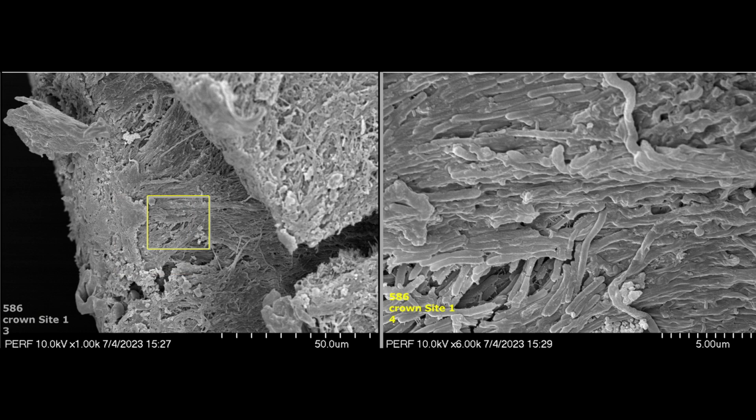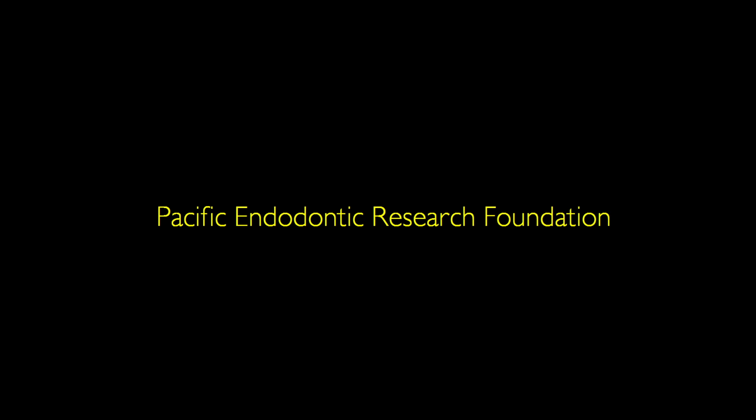So that's the second conventional irrigation case. I hope this has helped you identify some of the things you can have confidence in. And next, we're going to look at some laser and GentleWave cases using this background as an aid.